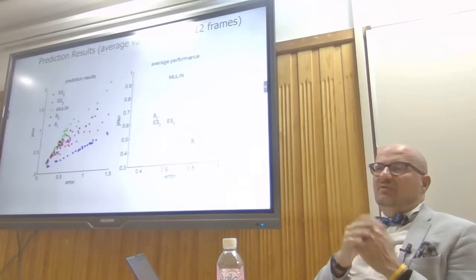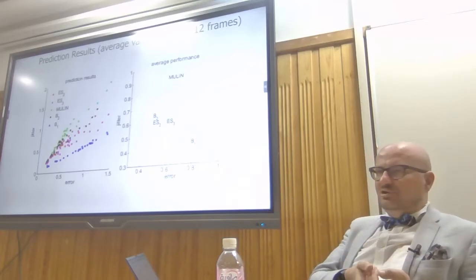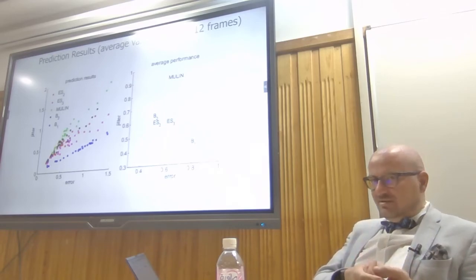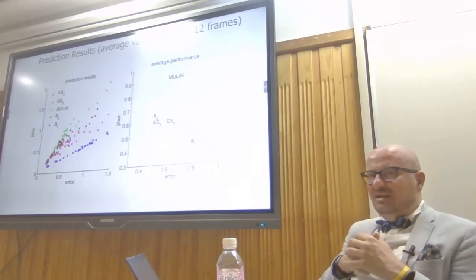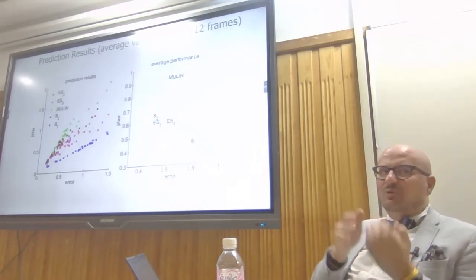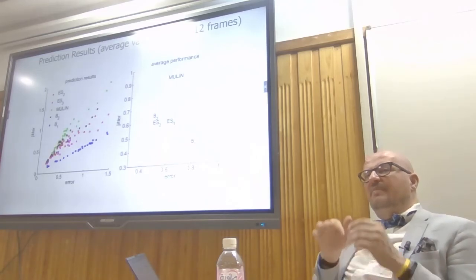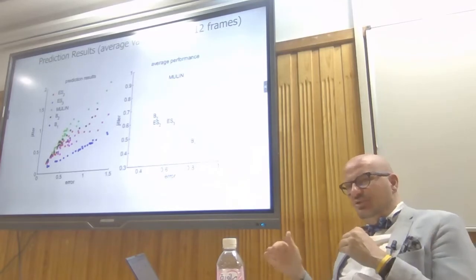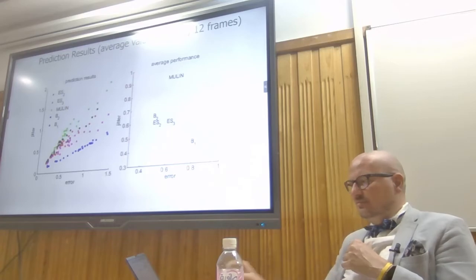And for some patients, in the beginning, when we lie on the couch, we are very afraid. So we really breathe very badly, and it means that you start from a worse model, but you have less jitter, and then the patient becomes calm, and you can switch to a better model and follow better.